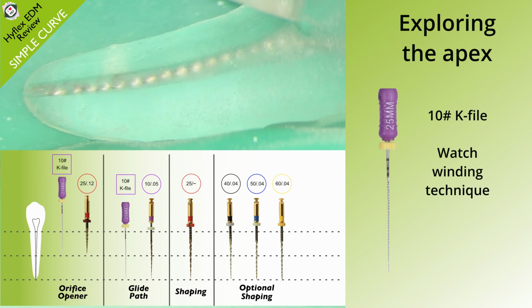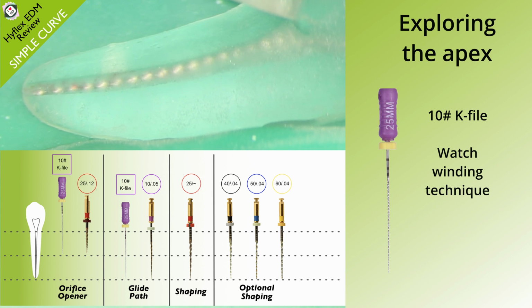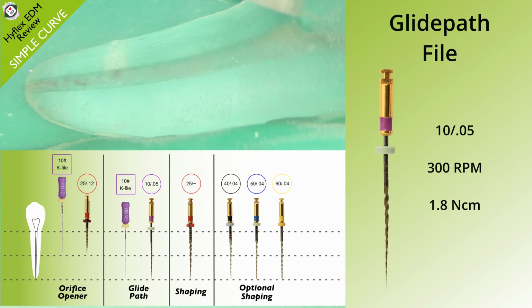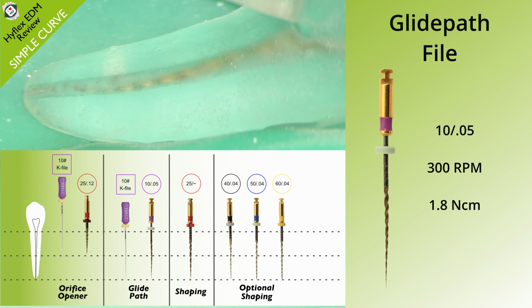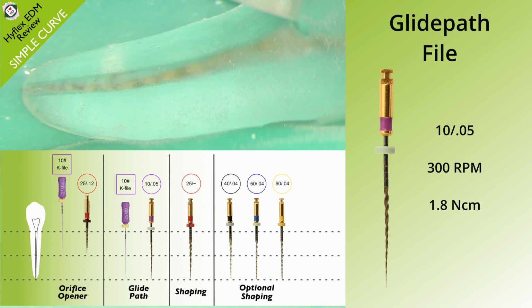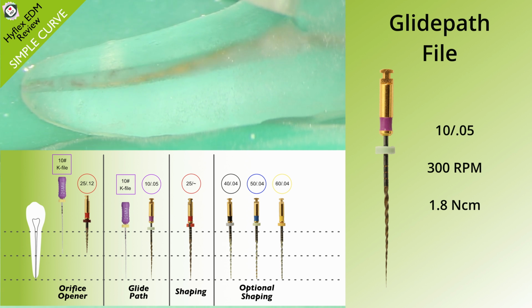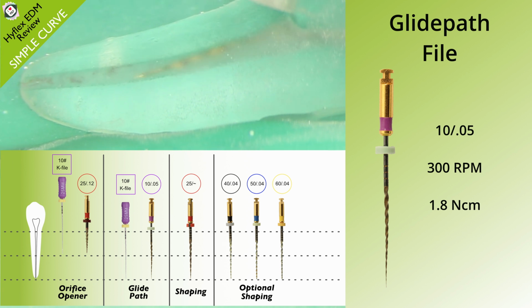Once the orifice is open, I'm then going to explore the apex with a size 10K file. Again, trying to widen the canal, ready for the rotary Glidepath file, which is the size 1005. This particular canal is very large, and the Glidepath file is having no issue at all at getting to length.